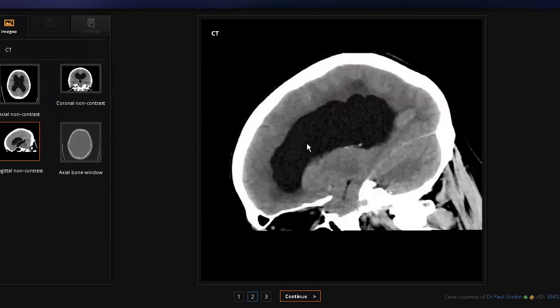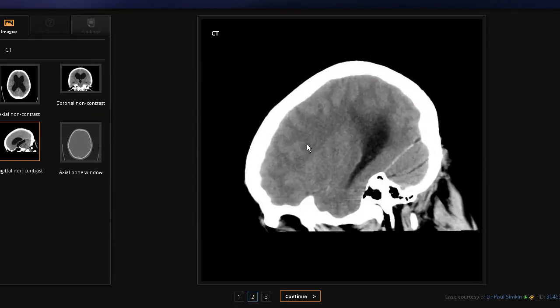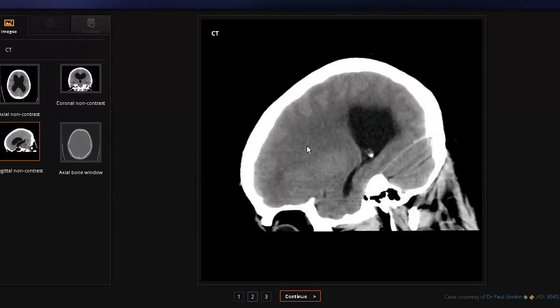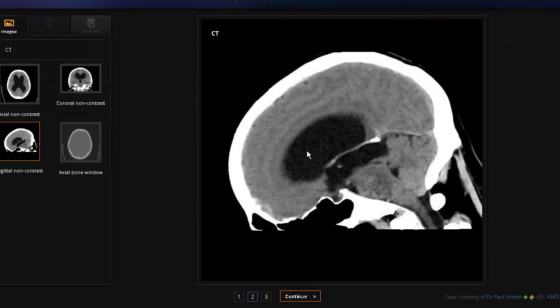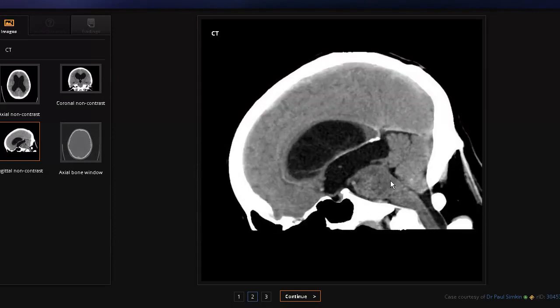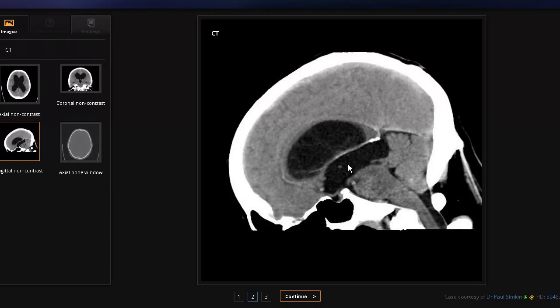Going down, we can appreciate the inferior horn, posterior and anterior horn, and then the third ventricle. Here we see the cerebellum — you can see the characteristic shape, arbor vitae, medulla, and pons. This diamond shape is the fourth ventricle, and it's quite normal, as is the cerebral aqueduct. So the obstruction is not distal to this, but proximal, affecting the lateral and third ventricles.